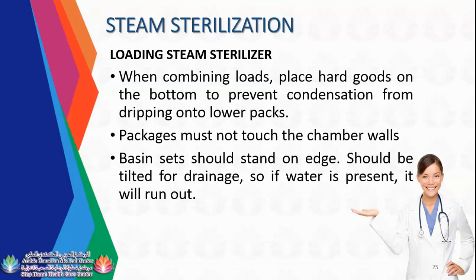But if you are placing hard trays or heavy objects in your storage area, you need to place them in the middle. In sterilization, in the autoclave, once you place the heavy instruments, you need to place them at the bottom part. But once you are finished sterilizing and you store it, you will place it in the middle of the storage area. Packages must not touch the chamber walls.